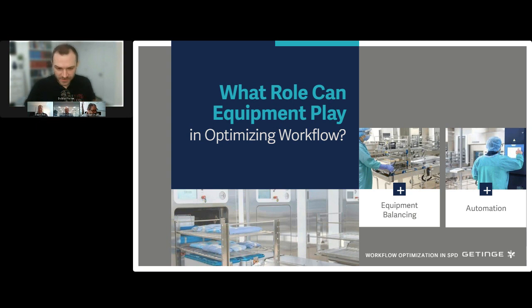And if you only zoom in with kind of the microscopic lens of number of instruments that one technician touched for the day, they might be right. Like, they might get through more work by using that method. But when you zoom out and look at the department data and like what instruments arrive to the patient, I think the data will show that it's more efficient to have that one piece flow that keeps the equipment running and keeps things moving through the department.